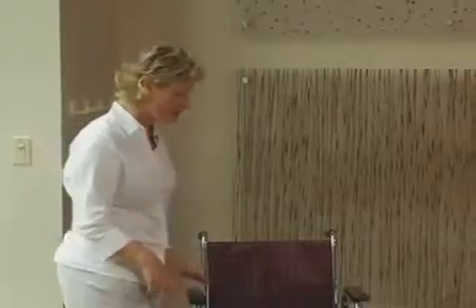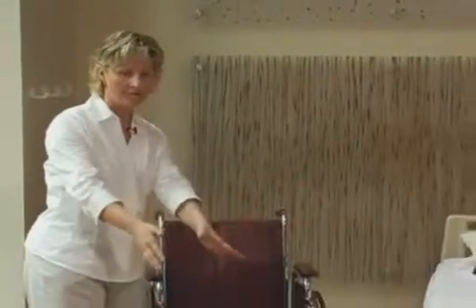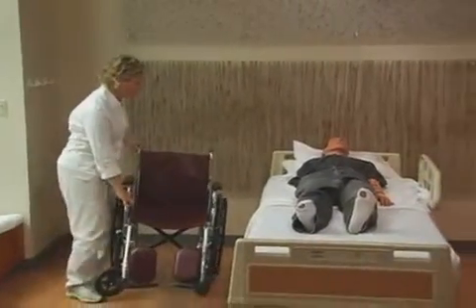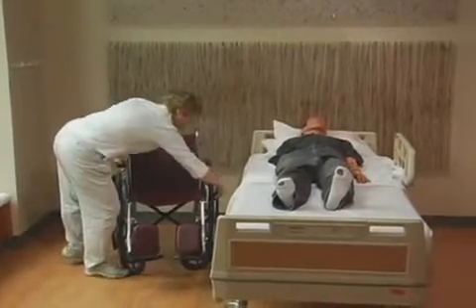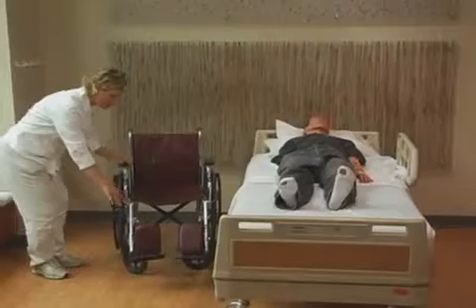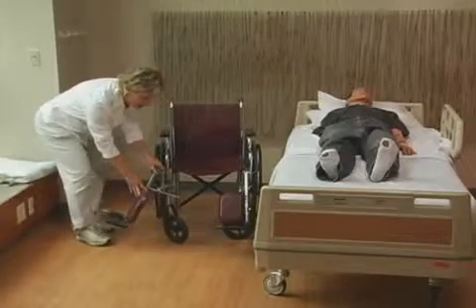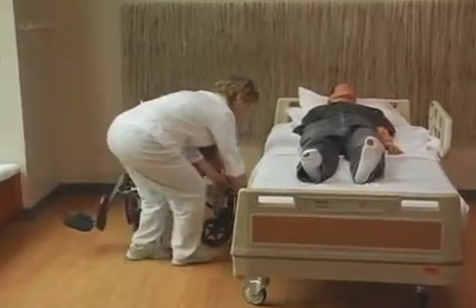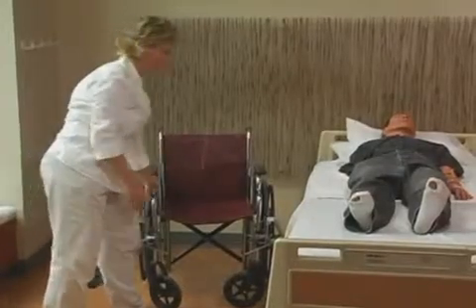Now we're going to get Victor out of bed and get him into a wheelchair. At home, when you get your patient out of the bed, you can put the wheelchair up here at the front or at the bottom, whichever works better. Sometimes there'll be furniture in the room that would be in the way. But we get the wheelchair right up next to the bed. You've got to be sure to lock the brakes on both sides. And then the wheelchair legs will swing away. There's a clasp on the side that you push and the legs swing away. On both sides, swing away. Okay? Brakes are on, leg rests are out of the way.